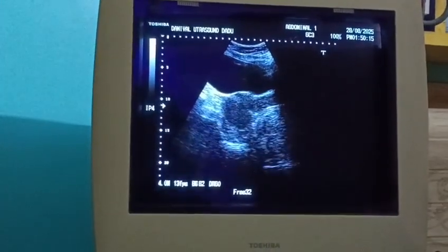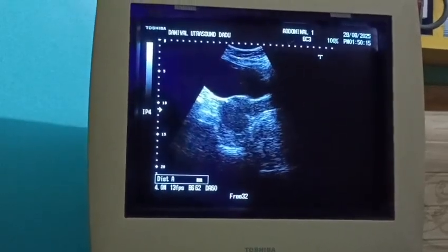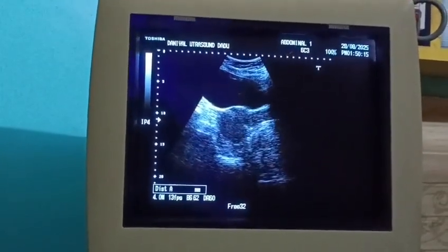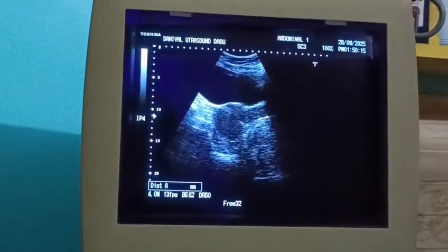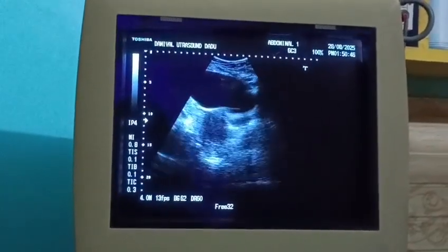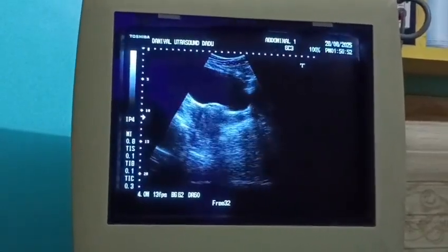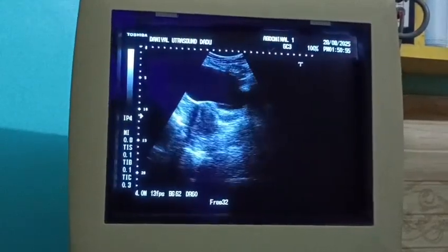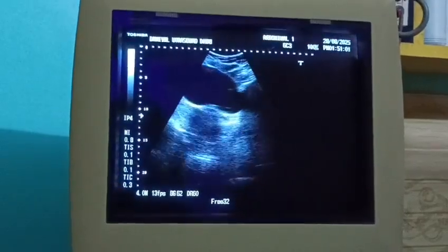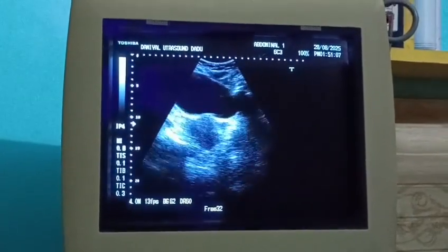Here is the cervix. This is the cervix, and this is the vaginal area. The uterine fundus is going down here. You see, here is the uterus. Here is a kink. So this patient has got history of the C-sections. So probably it is due to any adhesions or fixed retroversion and causing severe pain. This is the point. When I apply passive pressure, the patient feels pain and tenderness in this area, in the pelvic area. So our main focus is on the uterus, which is retroverted, acutely retroflexed, causing severe pain.